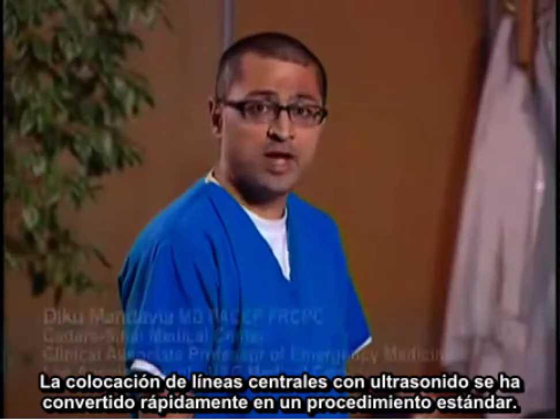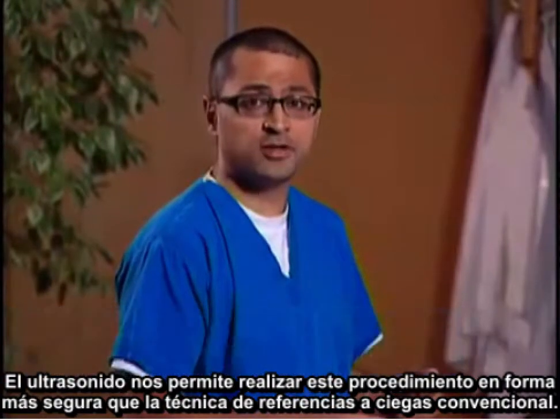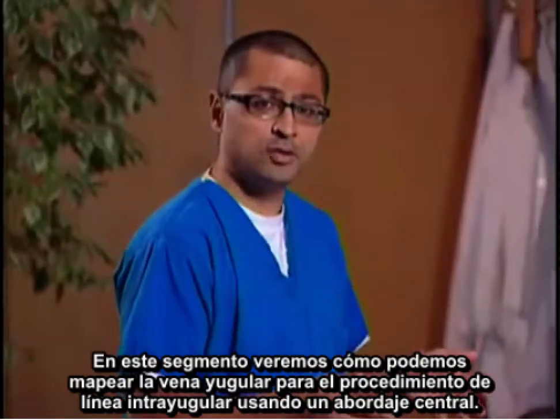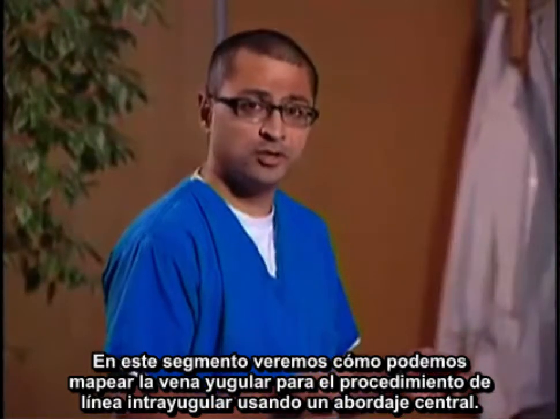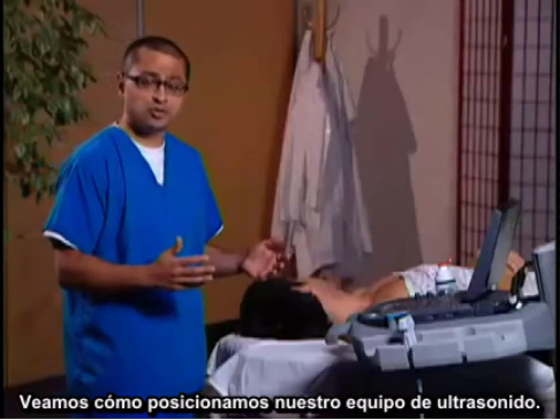Ultrasound-guided central lines are rapidly becoming standard of care. Ultrasound allows us to do this procedure much safer than a standard blind landmark approach. In this segment, I'm going to take you through how we can map the jugular vein for the procedure of an internal jugular line using the central approach. So let me show you how we'll position our ultrasound.